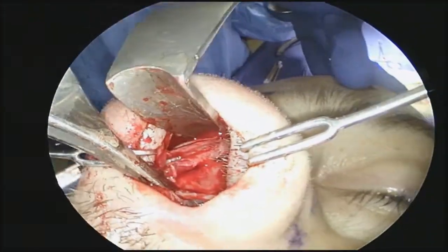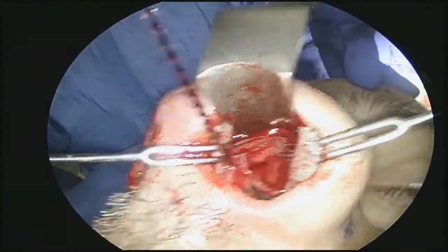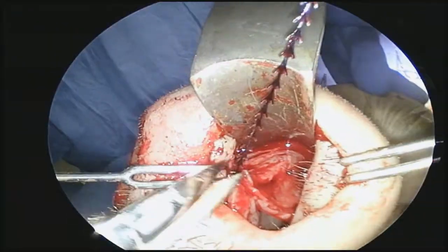We can confirm the correct position and securement of our spreader grafts. We then continue with the remainder of our rhinoplasty.